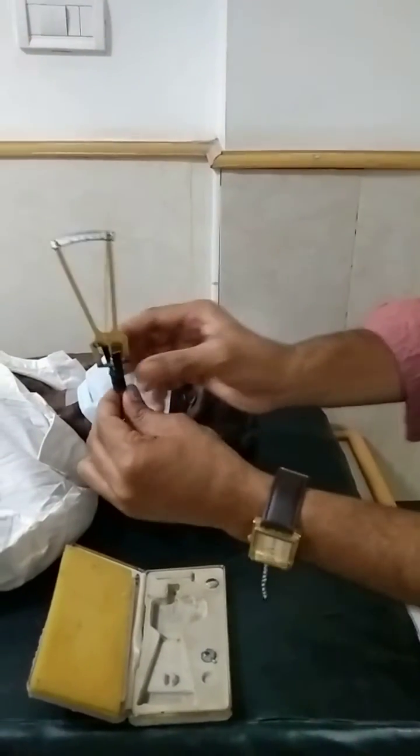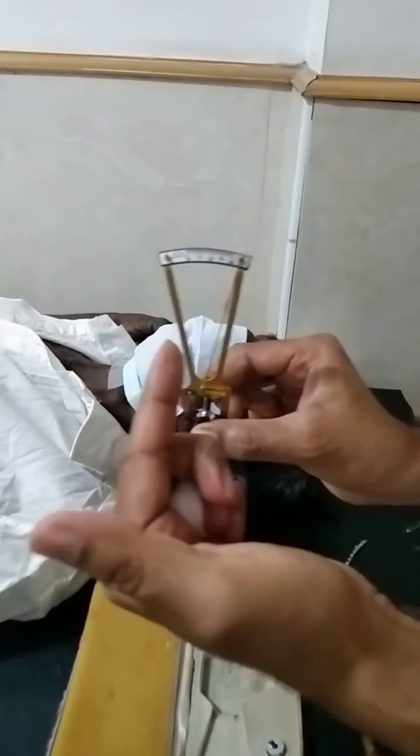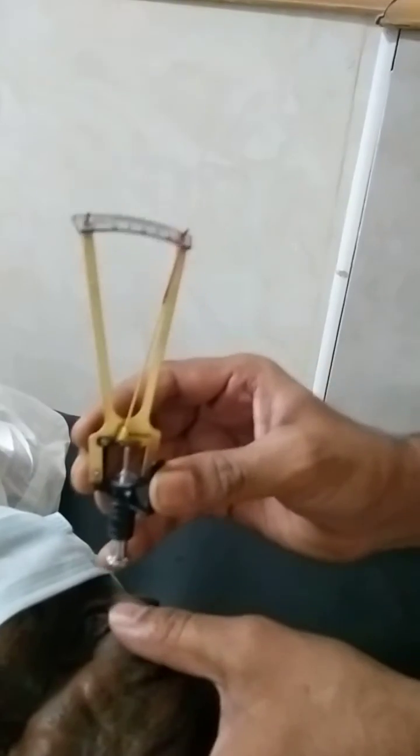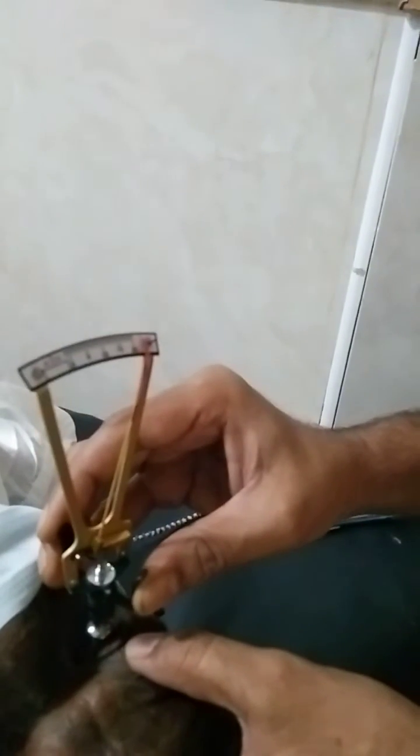When we check the patient's eye, we have to keep this plunger in our direction, as you can see here. Now we have to put paracaine drops in the patient's eye — whichever eye we want to check. Now slowly we have to pull the upper lid and lower lid and place this on the cornea. You can see that I am not at all pressing the plunger down — it is just the reading showing like that. You can see it is showing at 0.